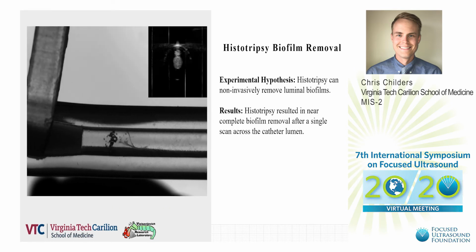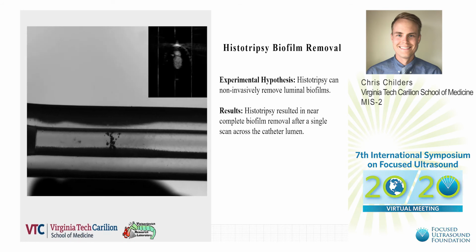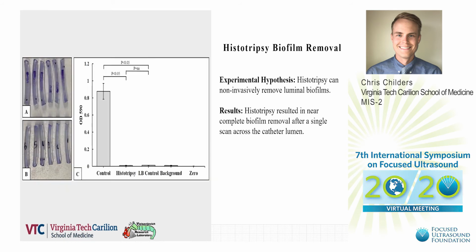Here is a video of one of our treatments in process. You can clearly see the optical as well as cross-sectional ultrasound imaging, and you can see that portions of the loosely adhered biofilm were removed rapidly by the histotripsy. The hypothesis of this experiment was that histotripsy can non-invasively remove luminal biofilms.